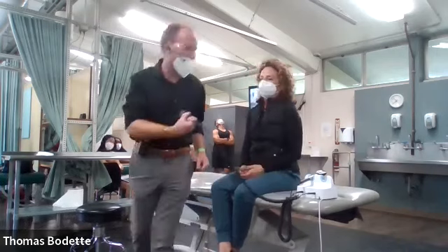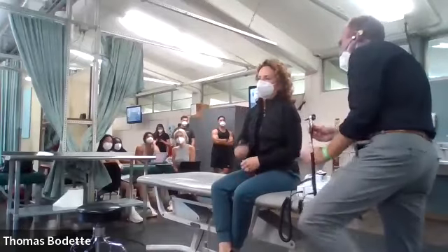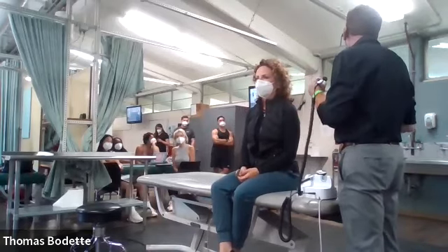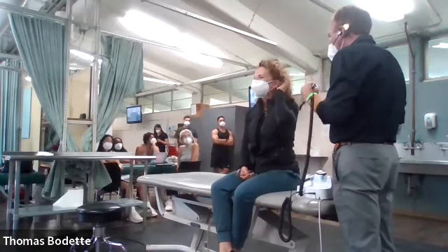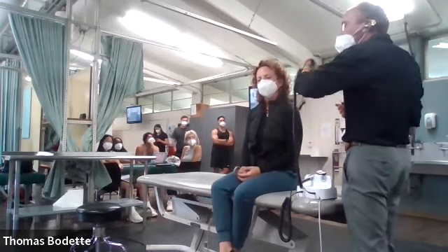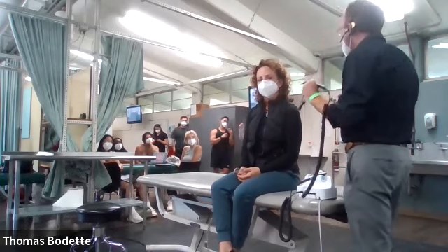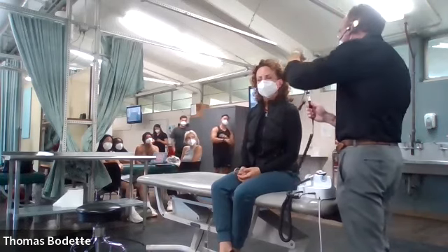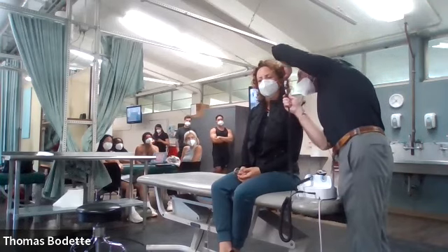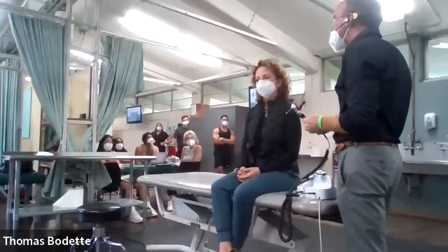Do this bilaterally, start with the asymptomatic ear first at all times. So everything is the opposite on the patient's left. Cone of light's going to be anterior, inferior, in this case about 7 o'clock. And everything else is opposite. Suppose you're right-handed and you're not confident holding the otoscope with your left hand like I am. That's perfectly fine. If you want to hold it with your right and bring your left hand up so you can pull it up and back, that's perfectly fine too. Make sense?